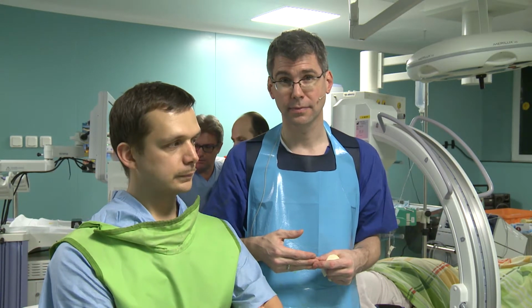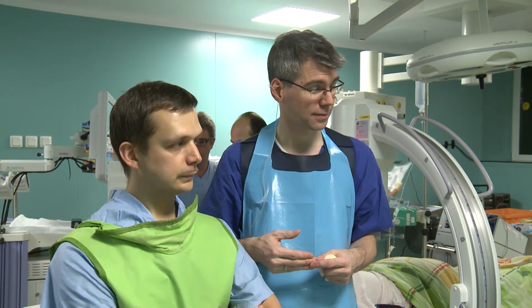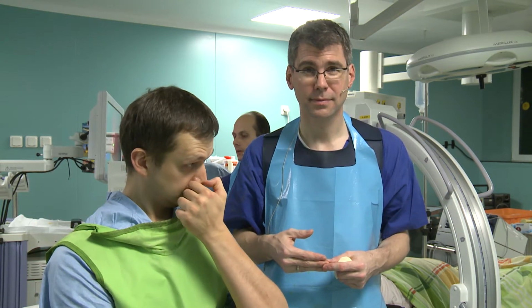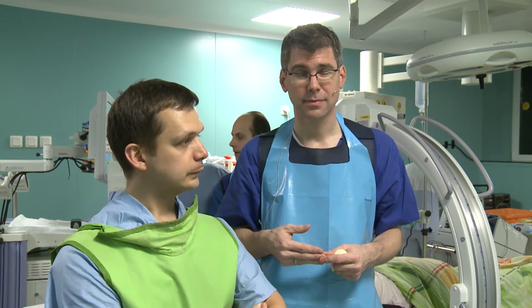So this is typical of the thickened wall. It might be. Can be. See in autoimmune cholangitis also.